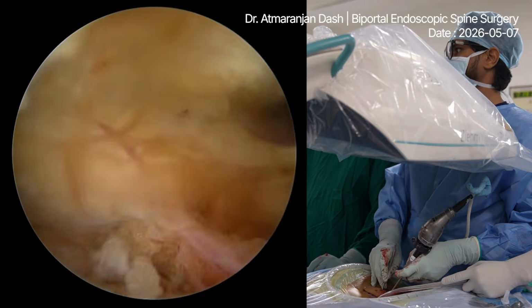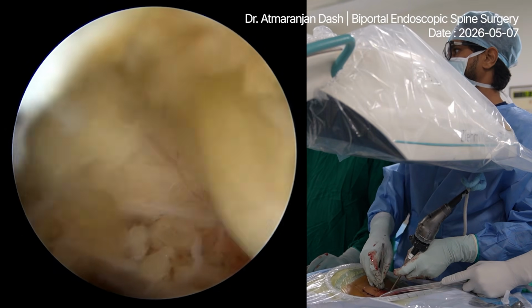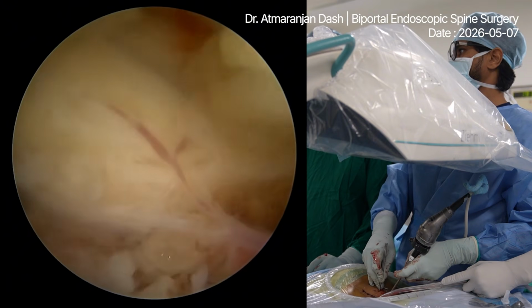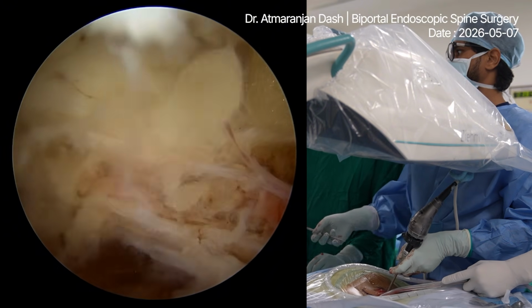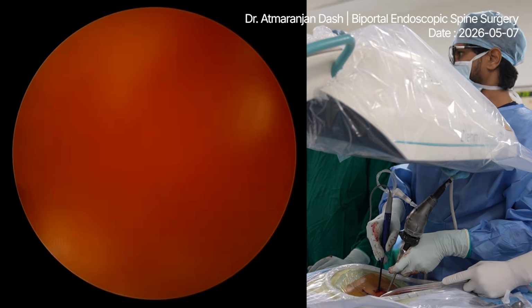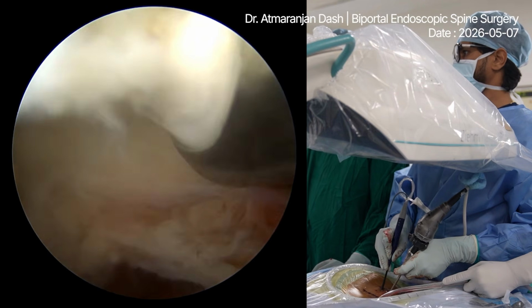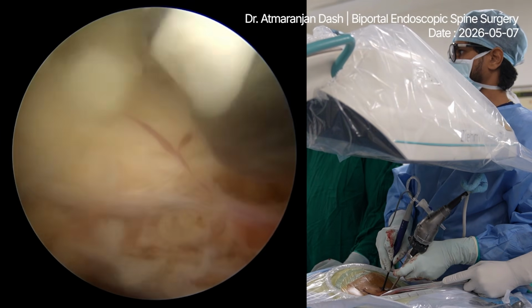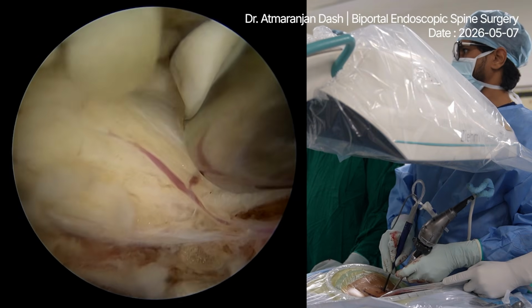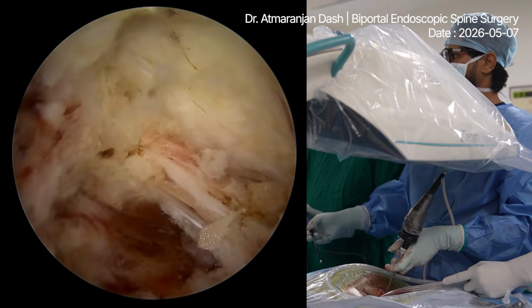You have to be very careful in these revision cases where we expect scarring. Coagulation. Saline. Coagulation. Okay. So hook, you have to be very gentle.